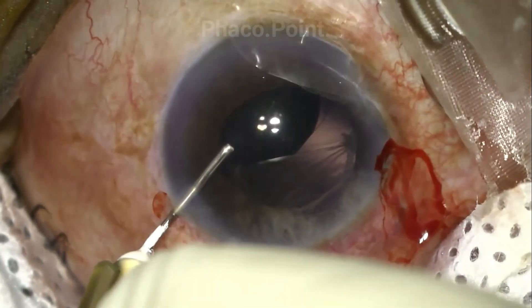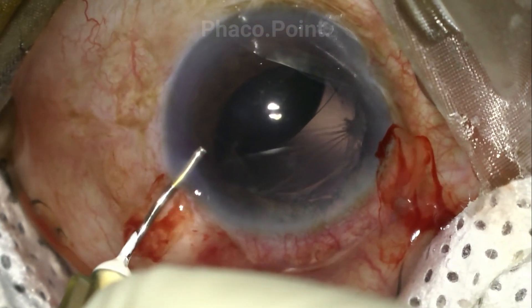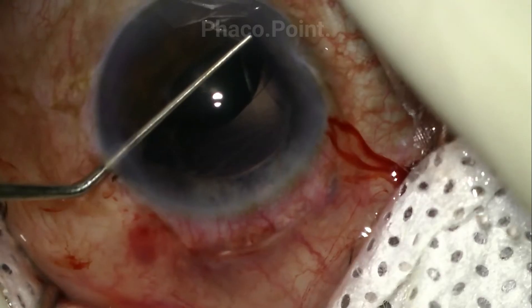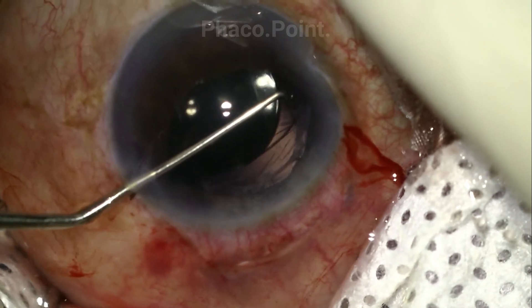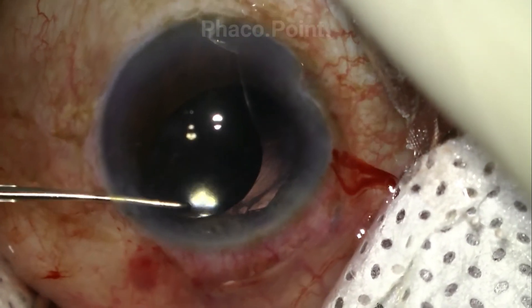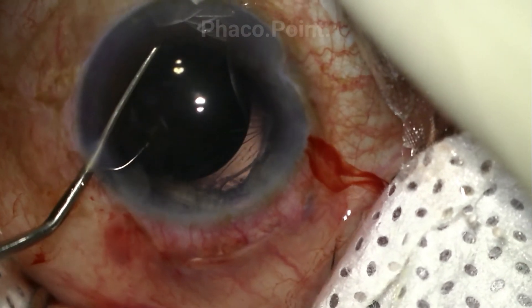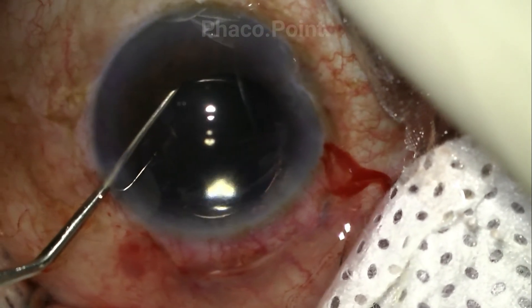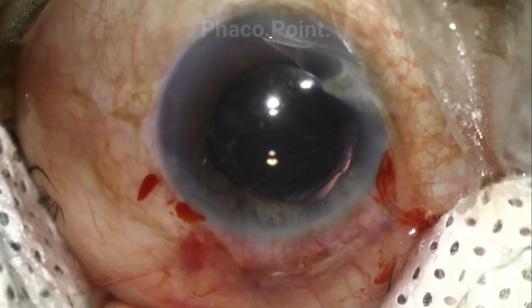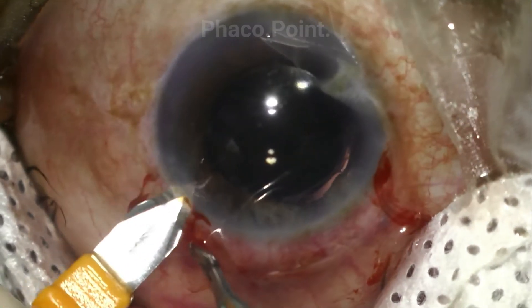Having done so, the surgeon reintroduces more viscoelastic into the anterior chamber and proceeds to bring the IOL into the anterior chamber. Using one or two instruments, he hooks onto the optic-haptic junction and, in an upward sweep turn by turn, both haptics are turned around, swept, and brought into the anterior chamber.